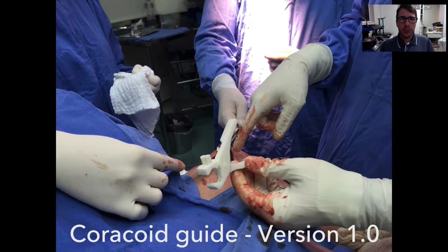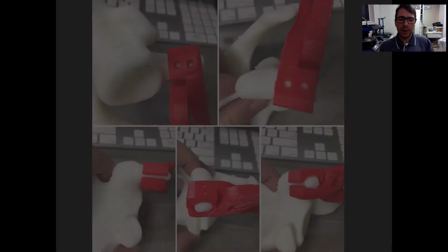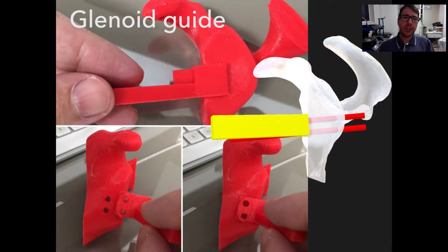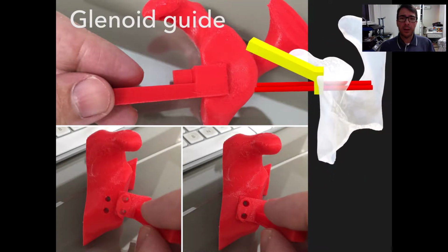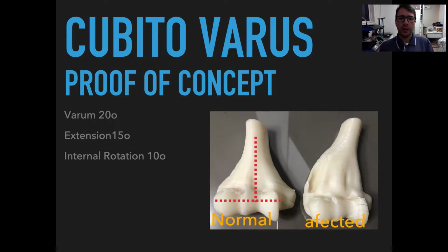Another option is to use patient-specific instruments. This is a patient-specific instrument. It's a coracoid guide that we have created. You can see here it's just like a plier, a very simple plier, and a patient-specific guide for the glenoid position of the screws, which can be developed very easily in any kind of software.